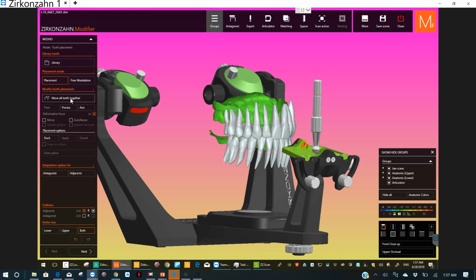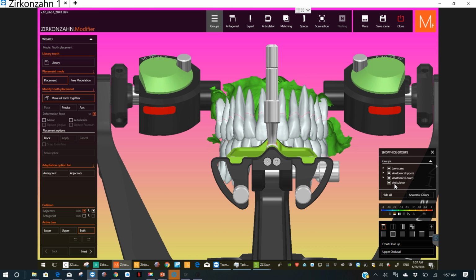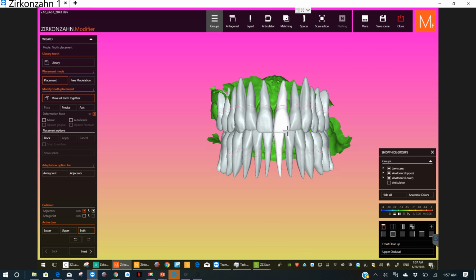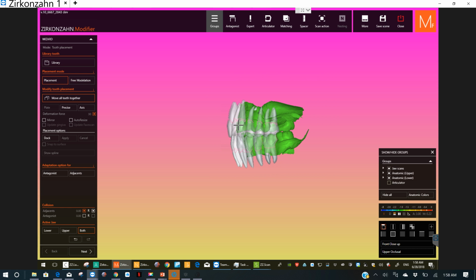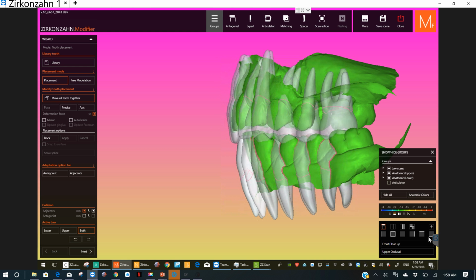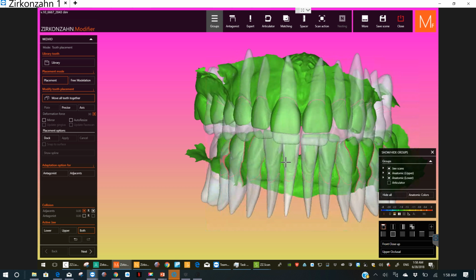Number one is I like to move them all together. So click move together and try to do it in the straight on views. I need to make those a little translucent, so roll the wheel to make things a little clearer. It's very, very annoying for people to have their teeth feel buck. So don't put this out more than 0.5 millimeter unless they're really, really caved in.